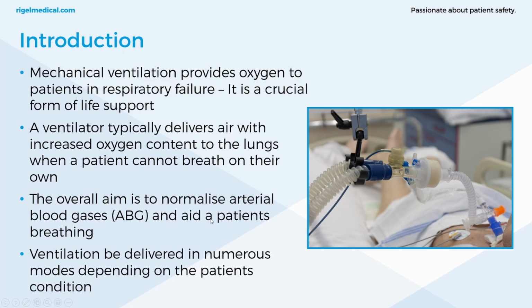Okay, so introduction to mechanical ventilation. Mechanical ventilation provides oxygen to patients in respiratory failure, so it's a crucial form of life support. A ventilator typically delivers air with increased oxygen content to the lungs when a patient cannot breathe on their own. So this is typically for the life support type ventilators, and the type of air that's with increased oxygen content is known as an air oxygen mix.